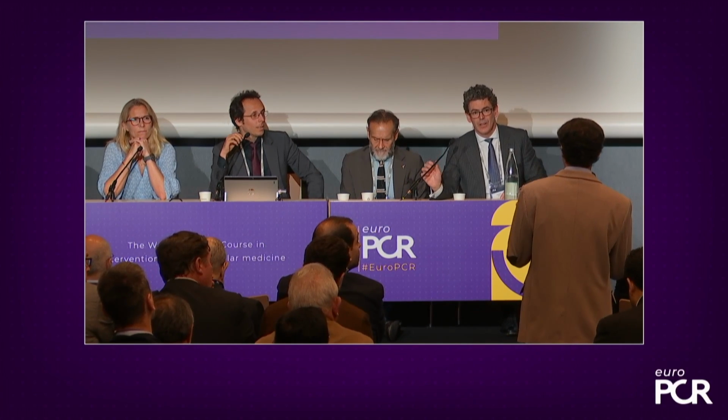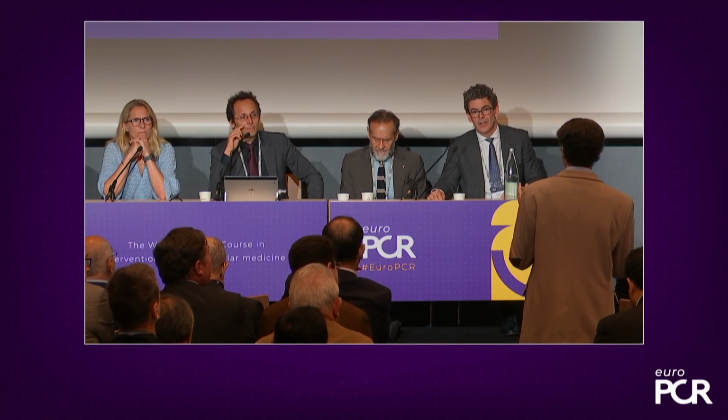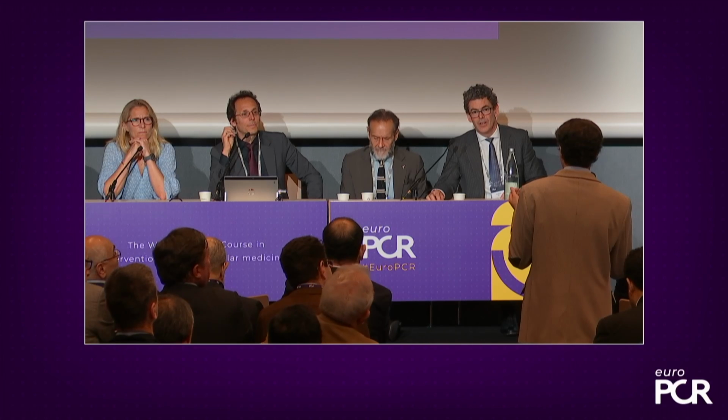Post-stenting wouldn't relieve the calcific nodule that we have seen after stenting, of course, with the IVUS. So I'd like to ask how the use of shockwave intravascular lithotripsy after the stenting can lead to improvement of this recoiling issue or not? Thanks.